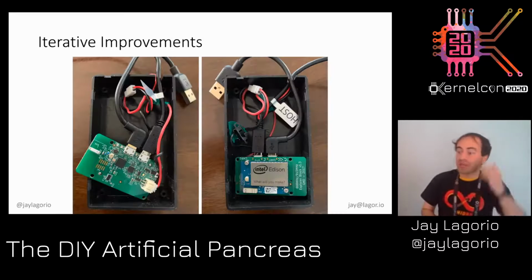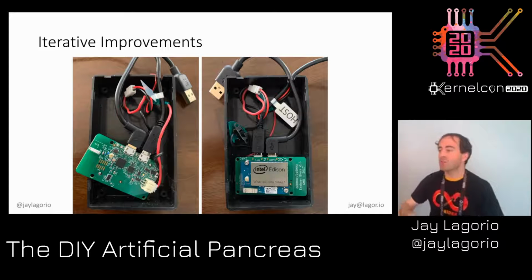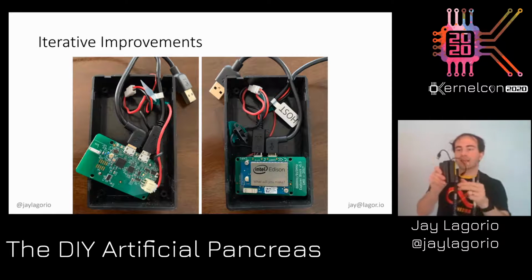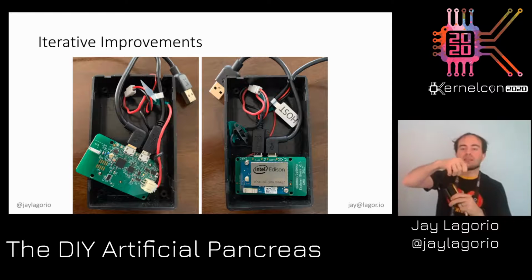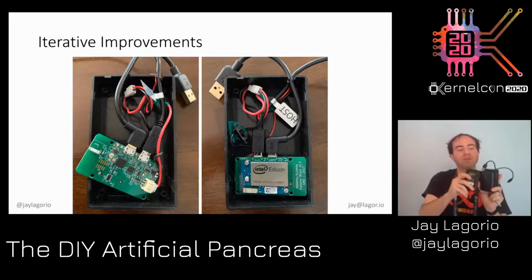These are better pictures of the Intel Edison with the radio board on it. That's the inside of this. This one is made so that you can connect via USB on the go. You can see the cable in the picture. This receiver, it's still pretty bulky. This battery gives you about, I want to say about 24 hours with it.